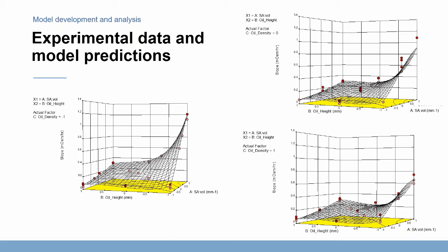Now, as you look at these two graphs on the right, you can see that increasing the density of oil does augment this problem to some degree. And it really only has its effect in the extreme section of this design space. And so as you increase the oil density, the rate at which the osmolality increases in this extreme section here drops. But it has not very strong effect in the middle part and the leftmost part of these areas in the design space. And so this really gives you the opportunity to think about how you might tailor an embryo culture system and what changes you might want to make and what changes wouldn't necessarily need to be made to decrease the rate of this osmolality change.